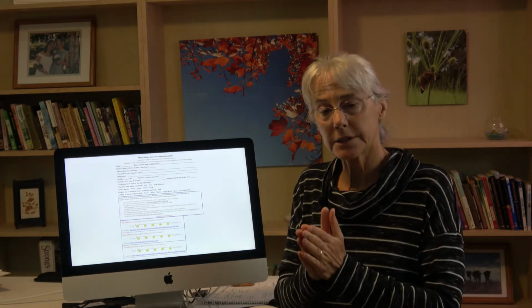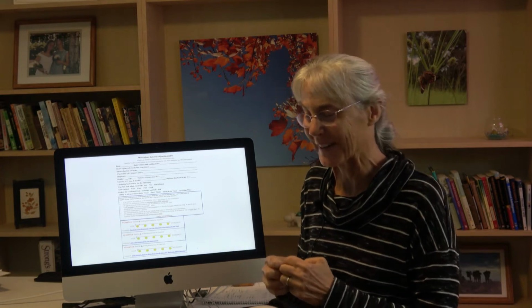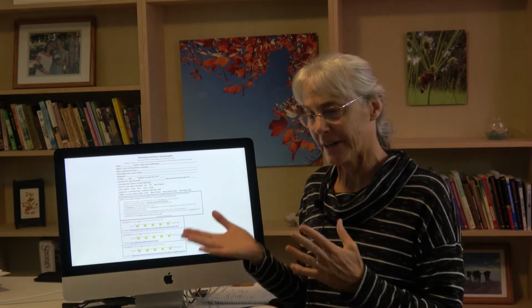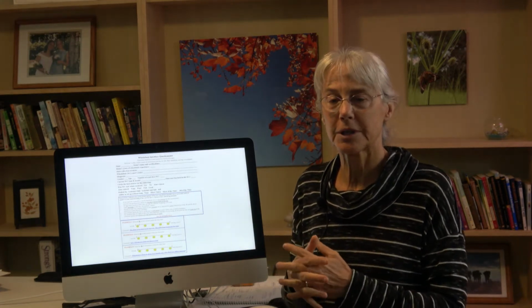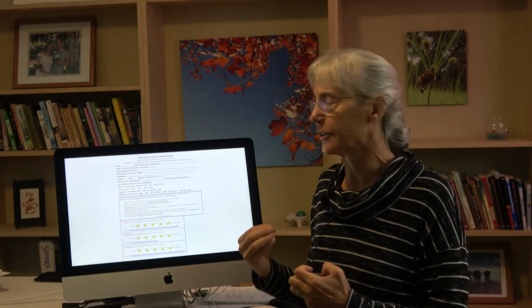This one does require a person. This is about the person in the wheelchair, really, and their wheelchair. And so unlike the Wheelchair Components Questionnaire, this one, if you're going to use it in the study, requires, of course, subject consent and assent and all that ethical stuff to be done correctly.